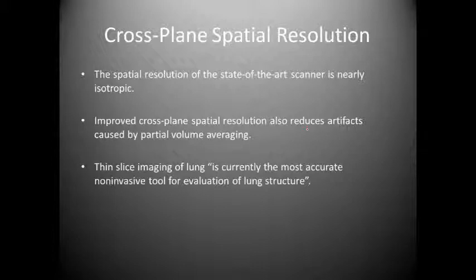Thin slice imaging of the lung is currently the most accurate non-invasive tool for evaluation of lung structure. And so that's something to keep in mind and put a star by, that this has become so accurate that it's pretty much a standard now for evaluating lungs.